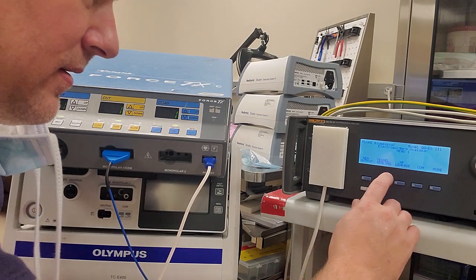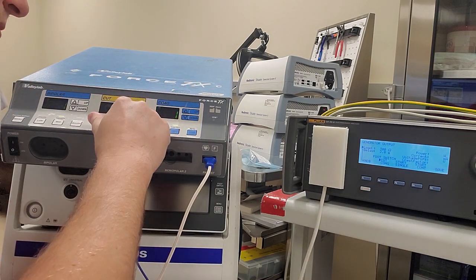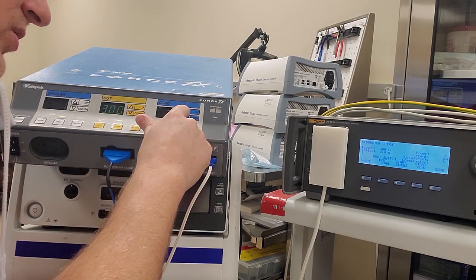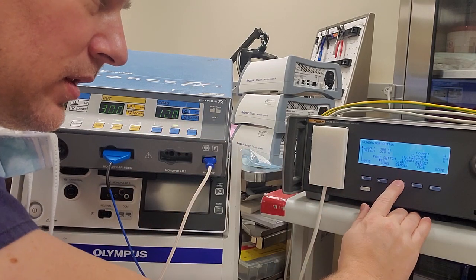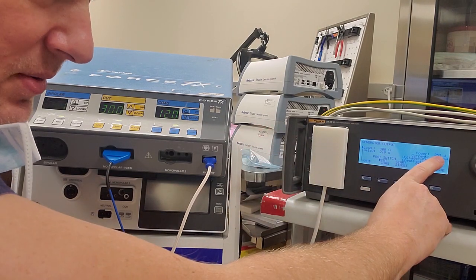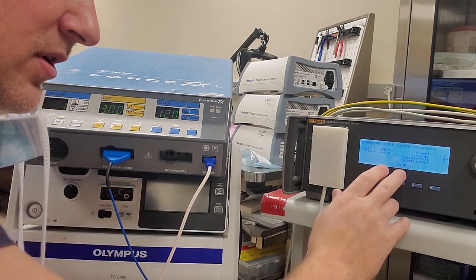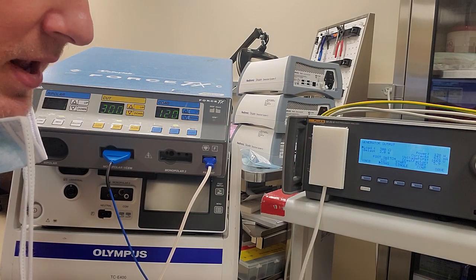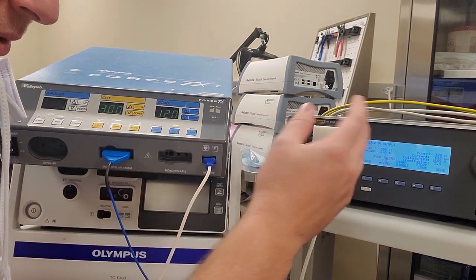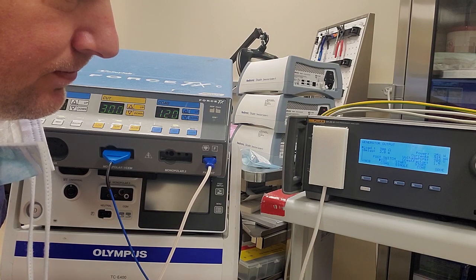We're going to run a baseline to show you guys how far off this unit probably is. We're going to go to general output, turn it up to 300 ohms, crank it all the way up to 120, and start single. This unit is reading 253 watts — it's off. Running COAG gives a perfect 120, but cut is reading 251 watts, so we're going to have to calibrate this guy.